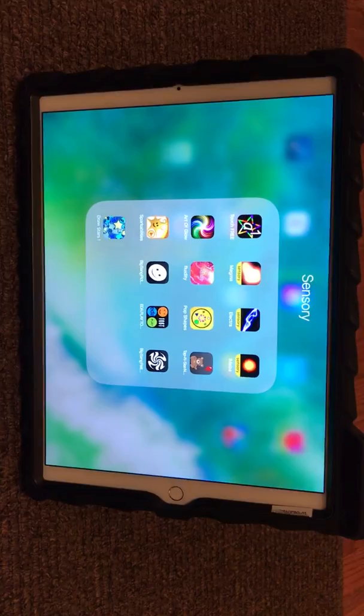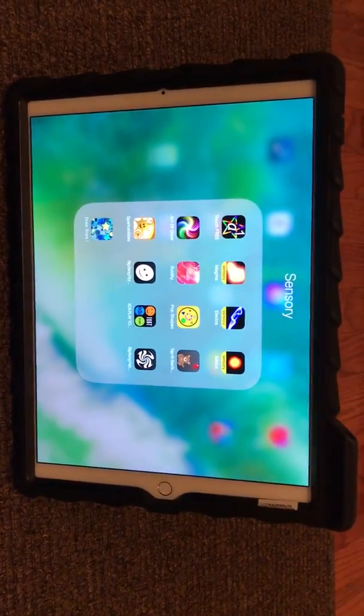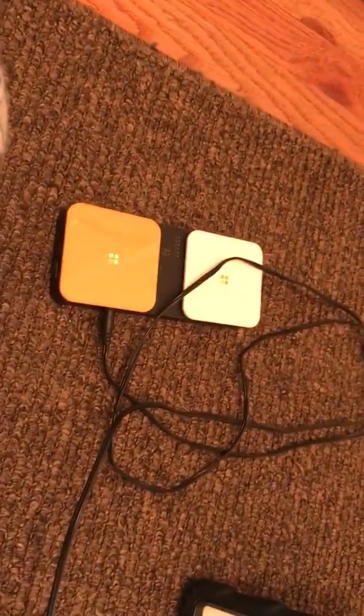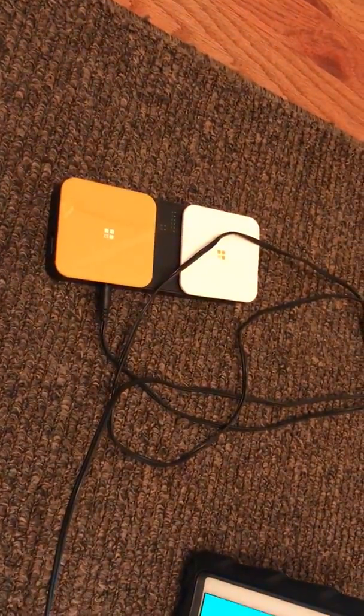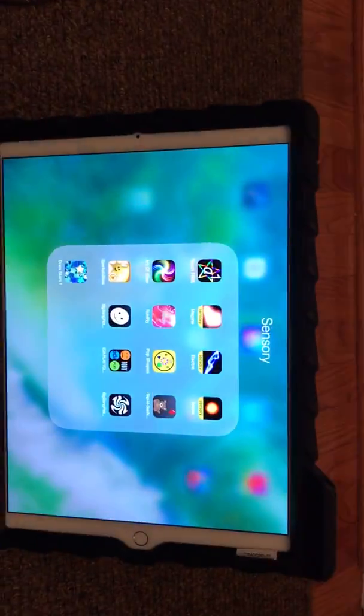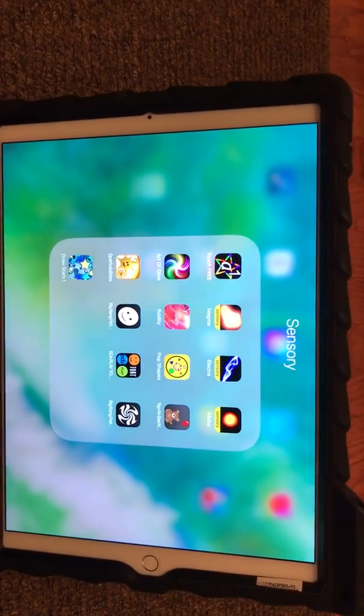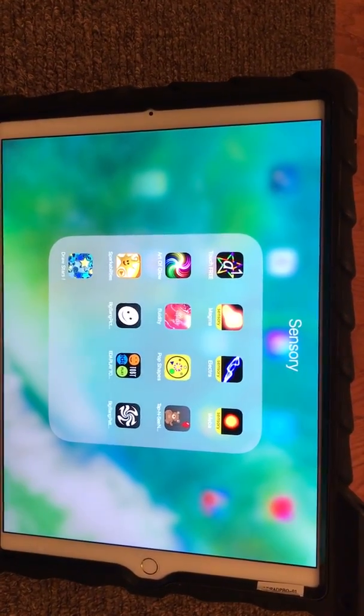There's some different settings that will allow you to change that and customize it for whatever you'd like. And that's how you're going to be using your Bluetooth switch to activate an app on the iPad.